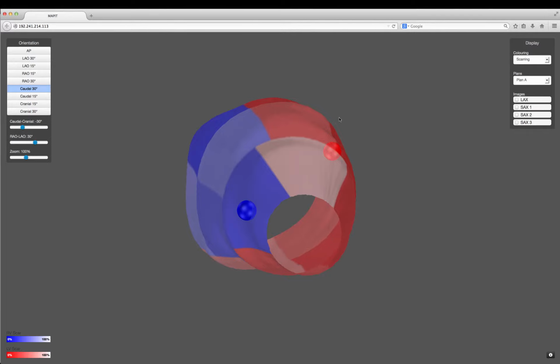If we cannot find a coronary vein branch that matches the 2 o'clock position, then you can move to Plan B by selecting plans on the right-hand side. If you cannot achieve Plan B, then we ask you to move to Standard Care.